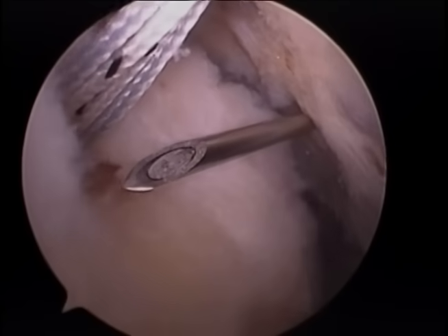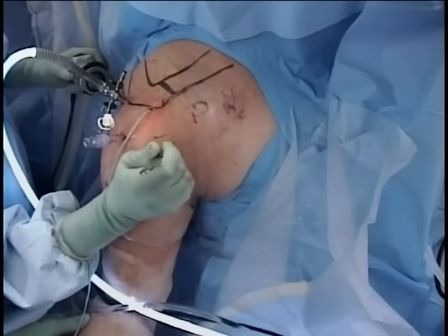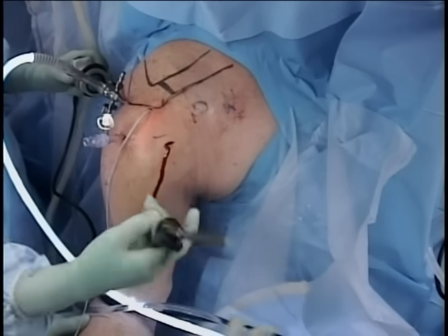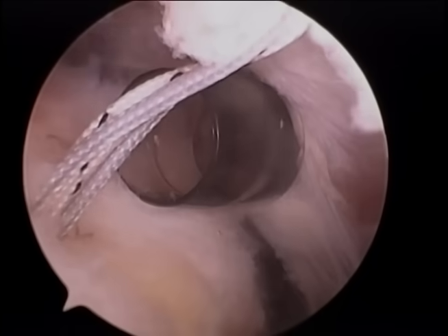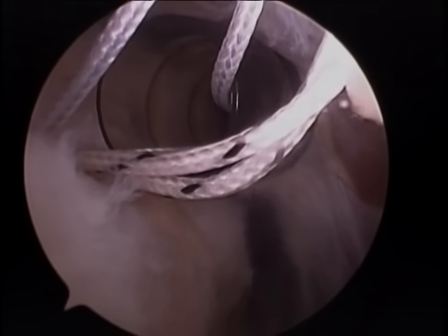We next must create an accessory portal, again with a spinal needle, make a skin incision, and then we insert another slightly larger black cannula you see here. We then use a suture retriever and retrieve our first suture through the cannula.